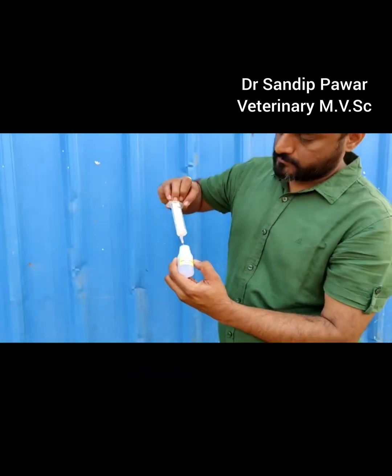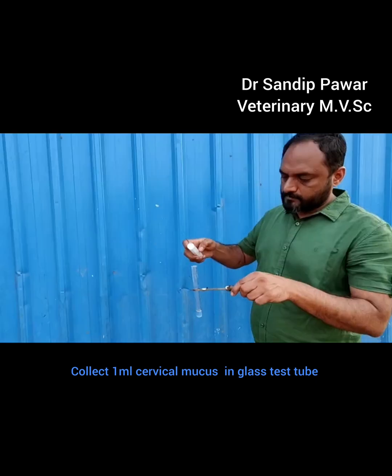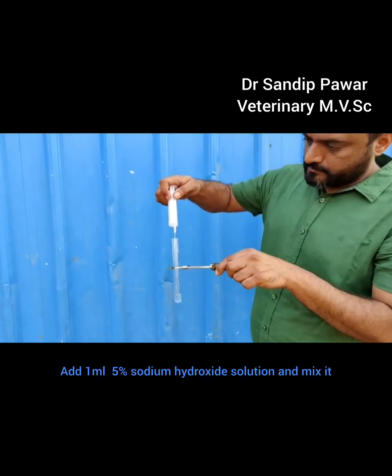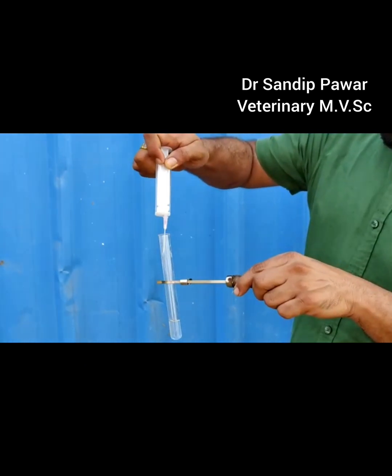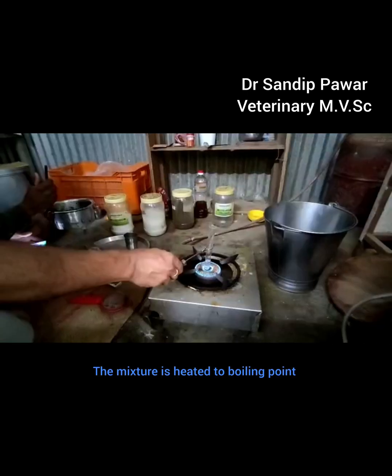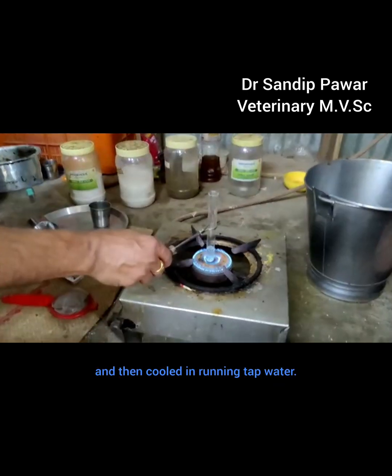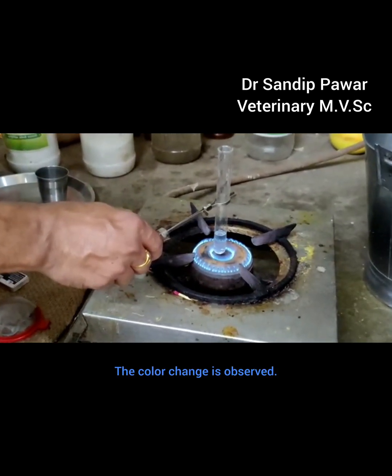The procedure of this test is: collect 1ml of cervical mucus in a glass test tube, add 1ml of 5% sodium hydroxide solution and mix it. The mixture is then heated to boiling point and cooled in running tap water, after which the color change is observed.